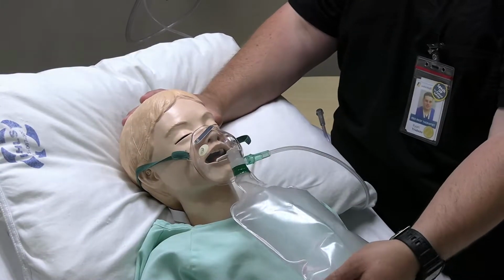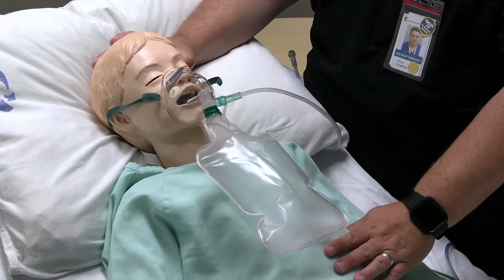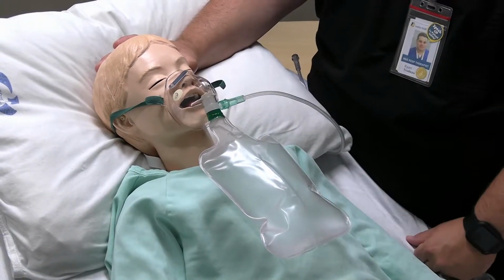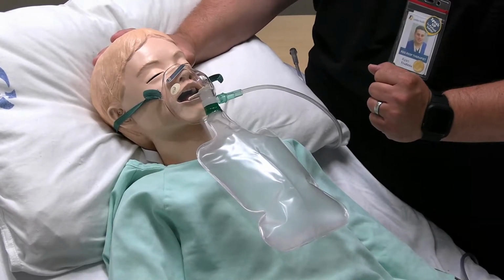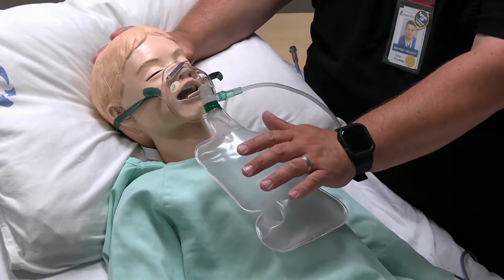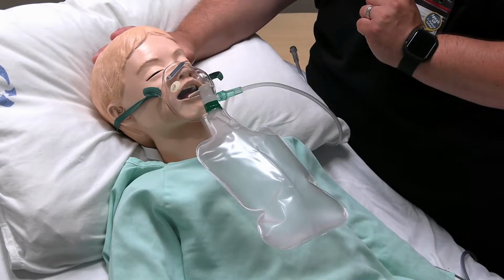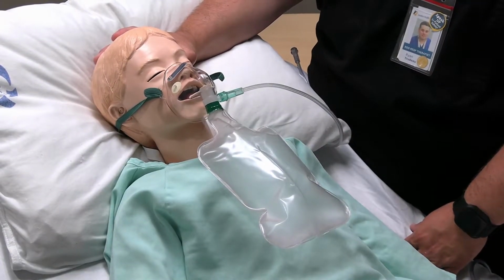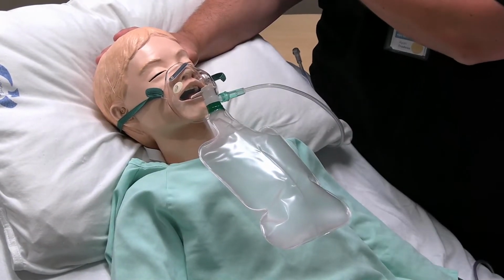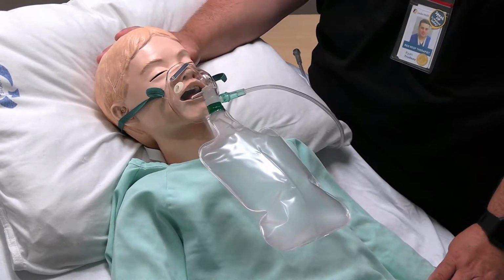Okay. You may see this bag tilting with their respiratory rate and inspiratory demand. You can see it kind of tilting there a little bit as the patient is breathing. You should never ever see the bag collapse. If the bag is collapsing, it means that you're not delivering enough flow for that patient's demands, so you may need to turn your flow meter up or consider an alternative mode of oxygen therapy.